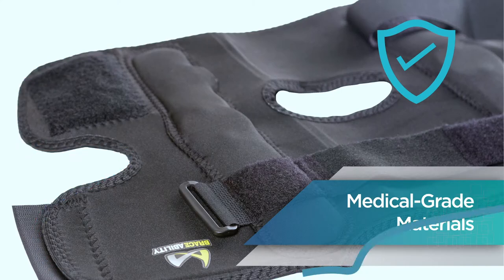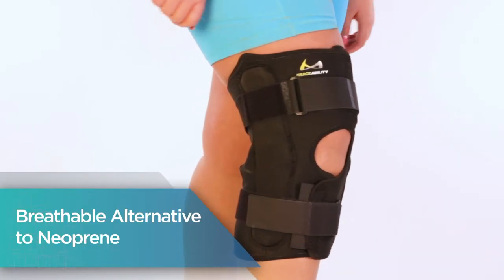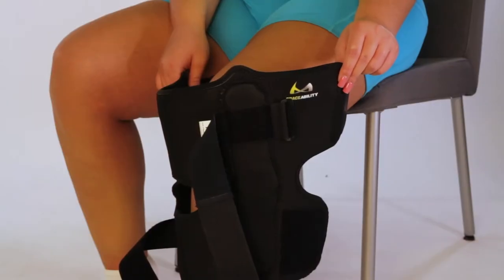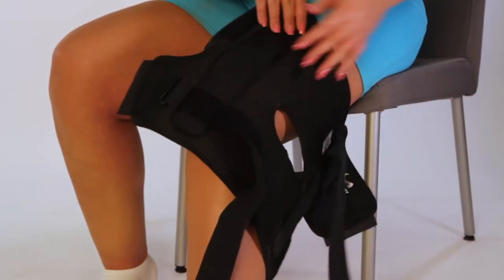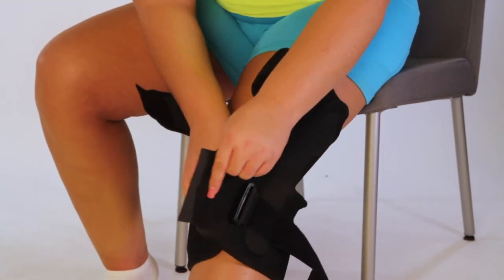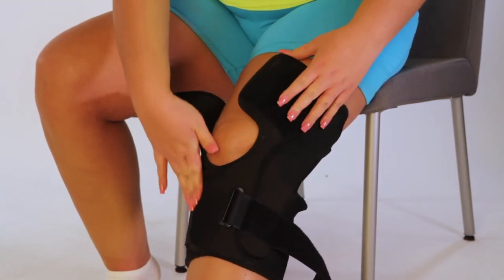Medical grade material is an excellent breathable alternative to neoprene. To apply, undo fasteners and lay brace flat. The logo signifies the top. Position behind the knee — logo should be in your right hand. Wrap the bottom snugly around the calf and secure. Repeat to secure the top.